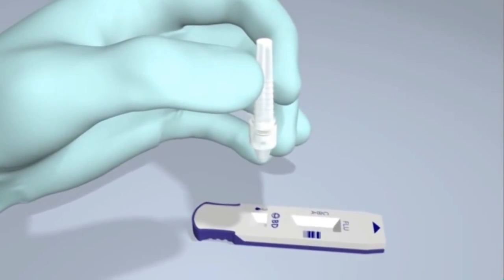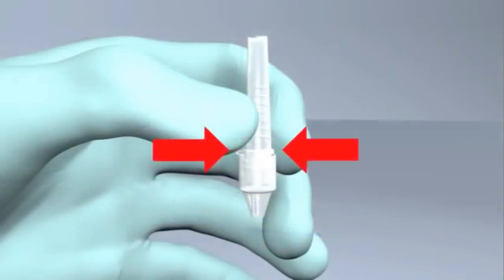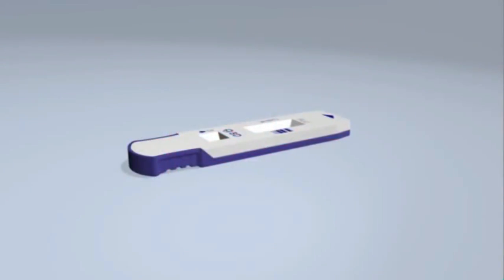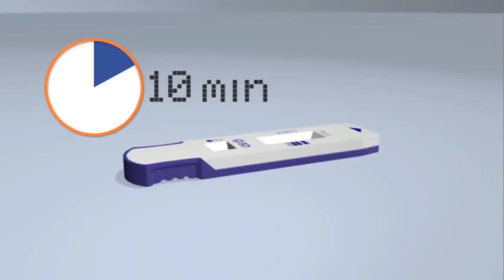Ensure that full drops are released, not partial drops with bubbles. Note that squeezing the tube too close to the tip may cause the tip to eject and the contents to leak from the tube. After adding the sample, wait 10 minutes for test completion.